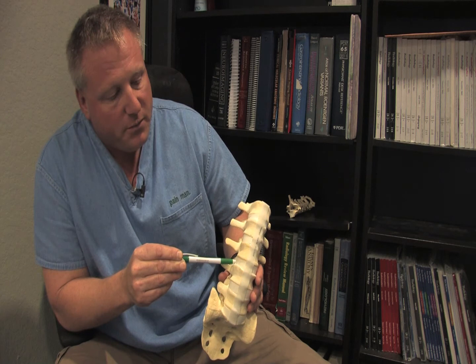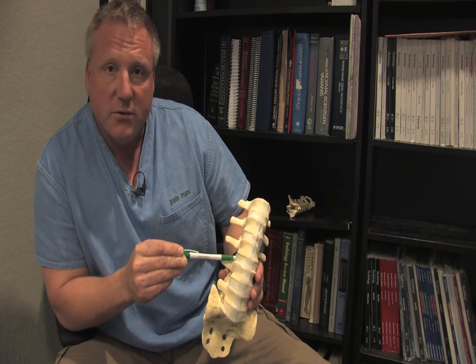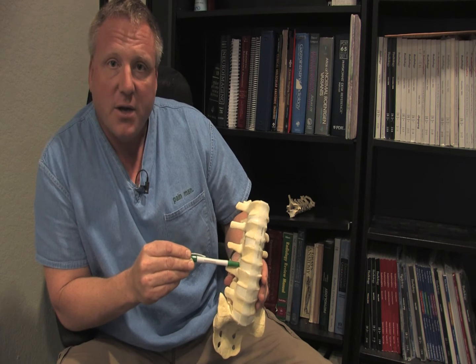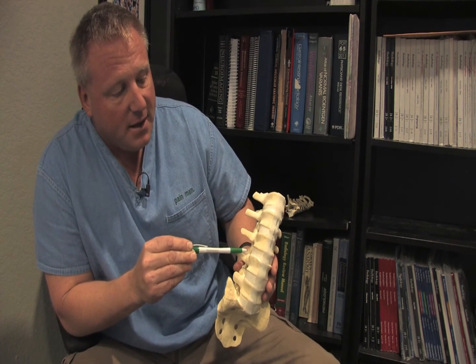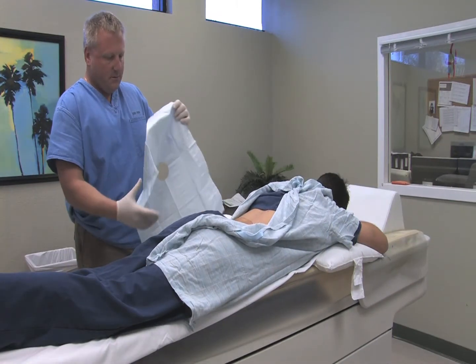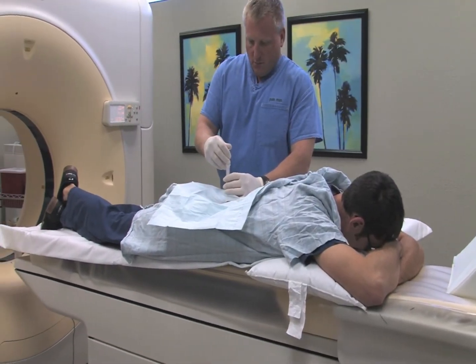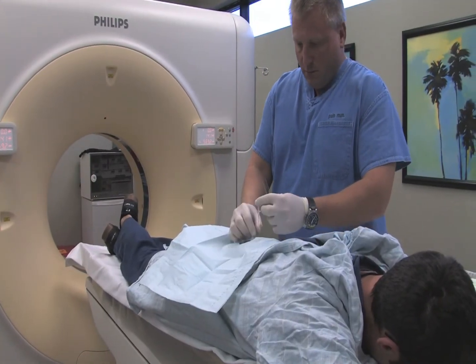A disc can push its way into the hole or foramen, press on the nerve root, and result in compression on the nerve root. The third thing is the ligaments and other tissues in the area can become inflamed and, similarly, press on the nerve root. The goal of today's therapy will be to place a needle from the skin surface, utilizing the CAT scanner to guide us, directly at the opening of that foramen and inject primarily cortisone with a small amount of long-acting Novocaine as well.